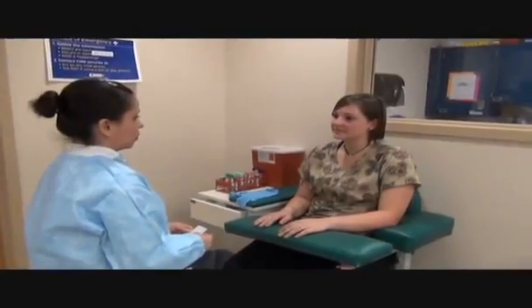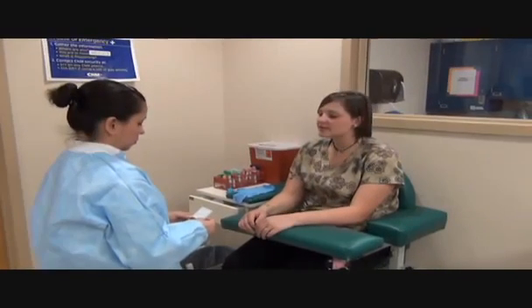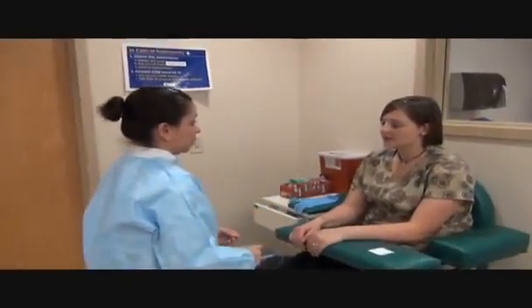Hi, my name is Desiree. I'm a CNN phlebotomy student. Do I have permission to draw your blood? Sure. Okay, can you please state your name and date of birth? Candace Hillerman, 08-03-1990. Okay, I'm going to go wash my hands and glove up. I'll be right back.